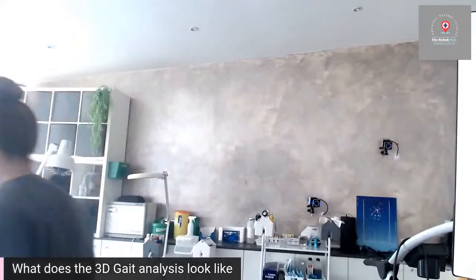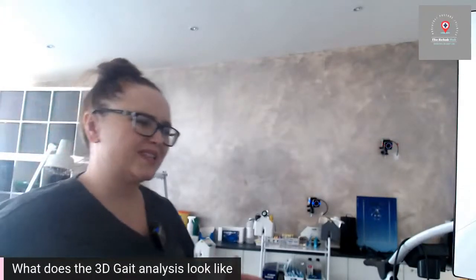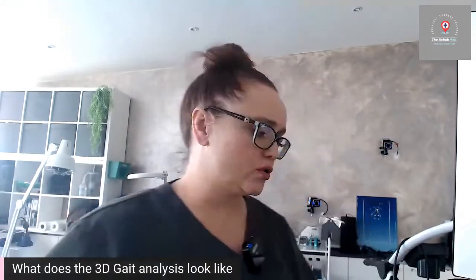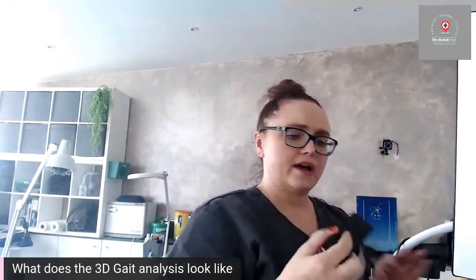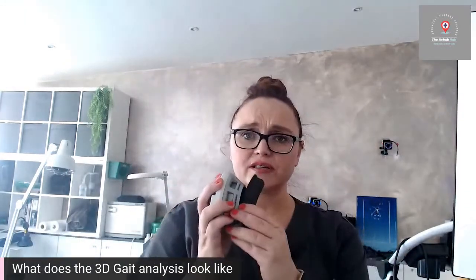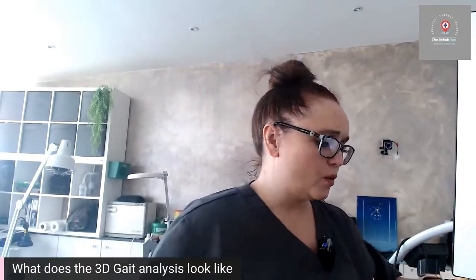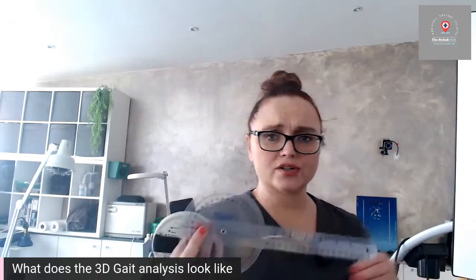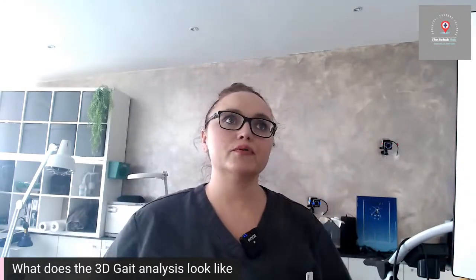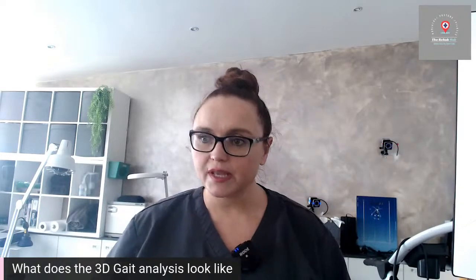When you come in for an analysis with us, we're not just looking at your gait, we also do a full musculoskeletal assessment. What does that mean? We look at your strength. We're doing strength testing, so we would literally have you resisting against us to actually measure the force that you're able to apply. We would use our goniometers to measure your joint angles, to make sure, for example, that you're able to activate the windlass mechanism in your feet.